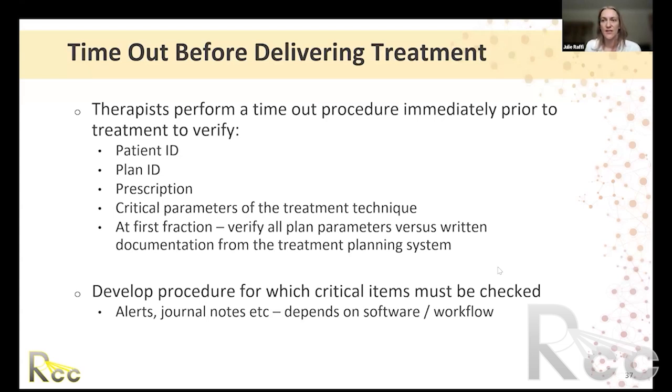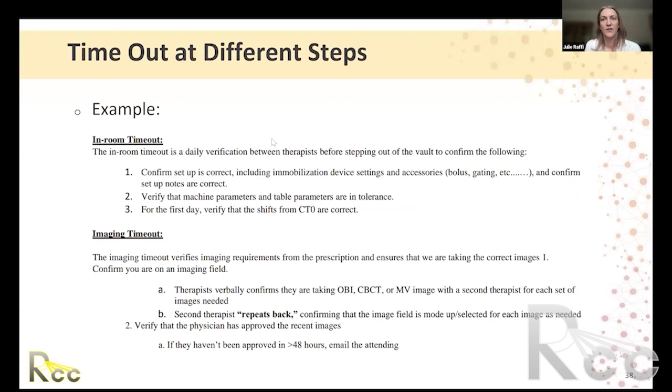So here again, it's important to develop a procedure for which critical items must be checked before patient treatment during your timeout. Depending on which system you're using, which kind of documentation, you might want the therapist to be checking for any alerts or journal notes or changes to prescription. It depends on your software and workflow where they should be looking for any critical updates prior to treatment each day. You can also have timeouts occurring at different time points or during different parts of the process.